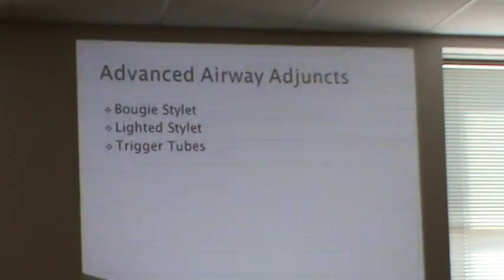Lighted stylets need a lot of practice to be effective, so you need a lot of time in the lab. Some people love them if they're experienced with it, but it's not a regular technique, so it may be a little bit more difficult to adapt. I've only done it twice, and I wouldn't feel comfortable trying to do a difficult airway with it, but some people swear by it.